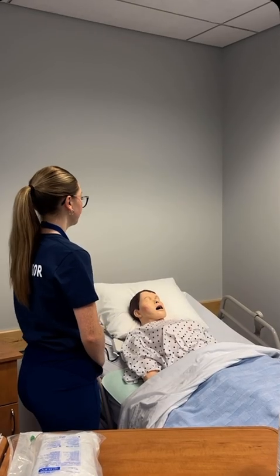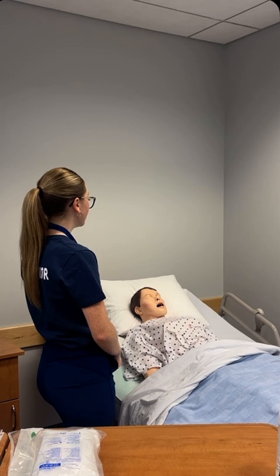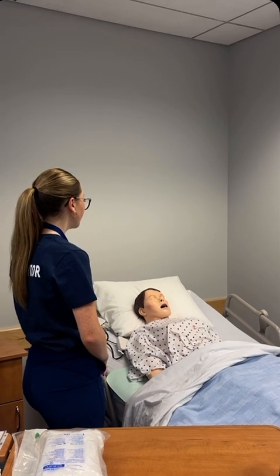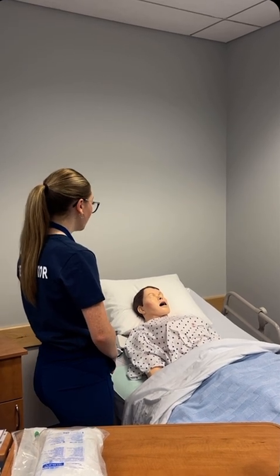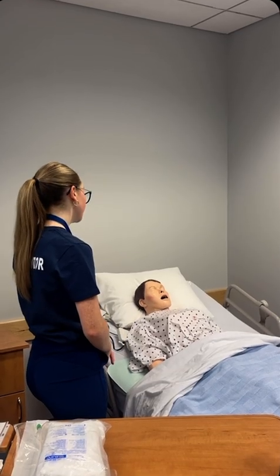Explains procedure to patient and obtains verbal consent. So the reason why we are inserting the catheter today is because we've been having difficulty voiding. So the catheter is going to help drain your bladder. Do you consent to this procedure?